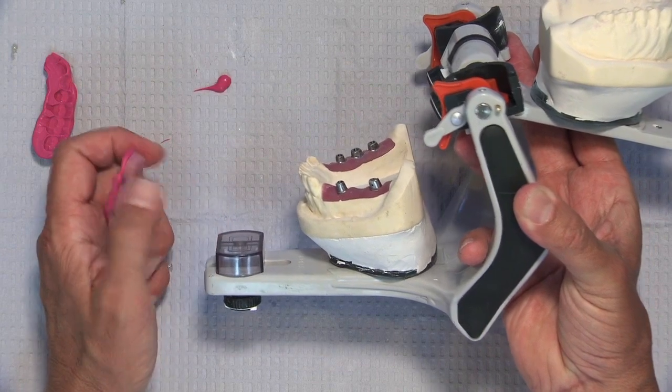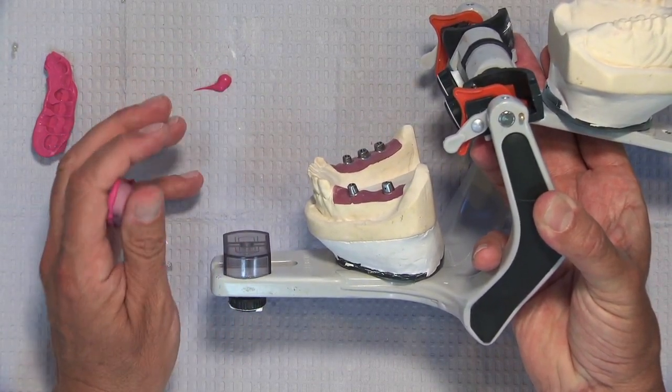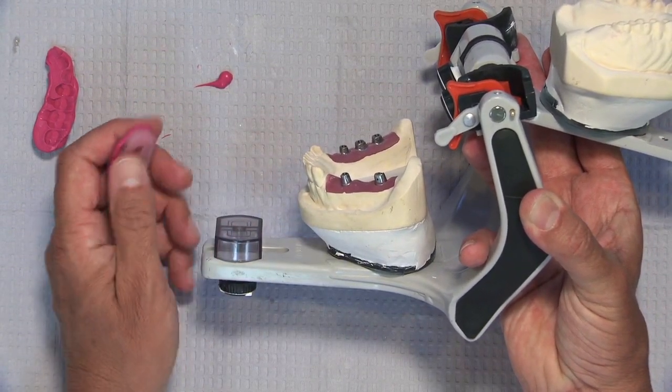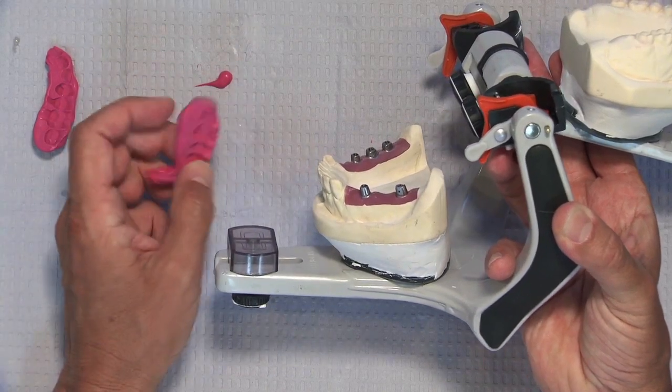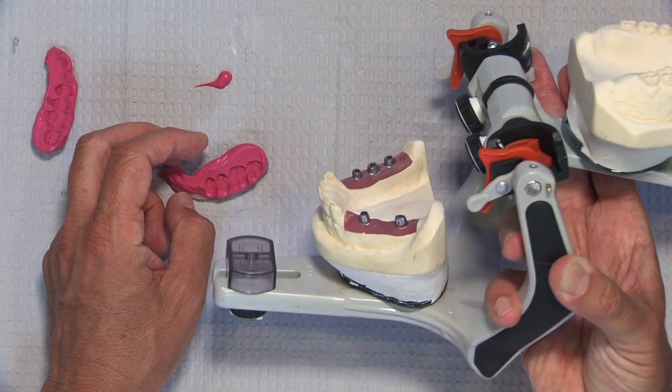So again, with the use of this positioning bite index in conjunction with some custom abutments, we're able to really solve one of the big problems that we see here in the laboratory, and that is to be able to accurately dial in the occlusion on a Kennedy Class 1 or a Kennedy Class 2 clinical situation where we've lost all the posterior teeth on either one or both sides.